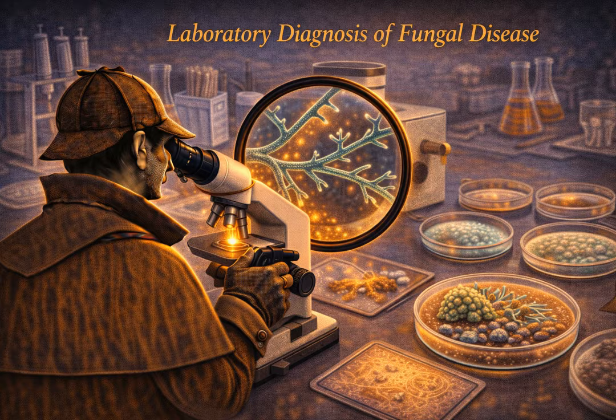Now, there's one more special media requirement Murray mentions that feels like a piece of trivia until you realize how common the infection actually is. The olive oil clue. Ah, yes. Malassezia furfur. This is the fungus that causes tinea versicolor. Those flaky hyper or hypopigmented patches on the skin that people often notice in the summer when they tan. That's the common outpatient presentation, sure.